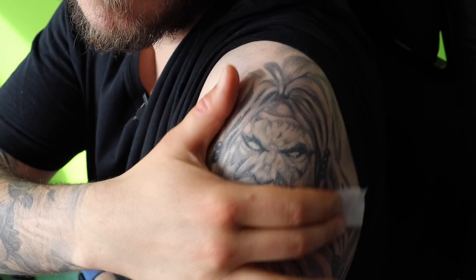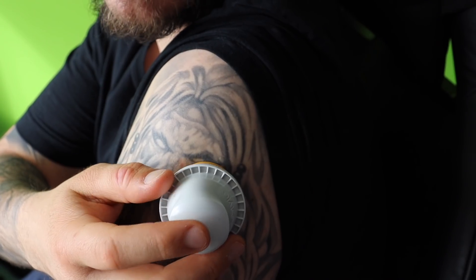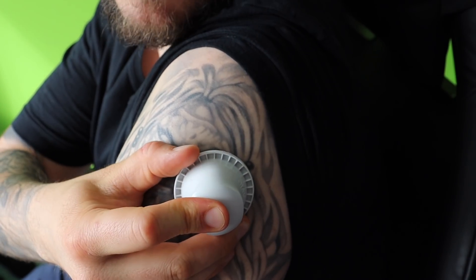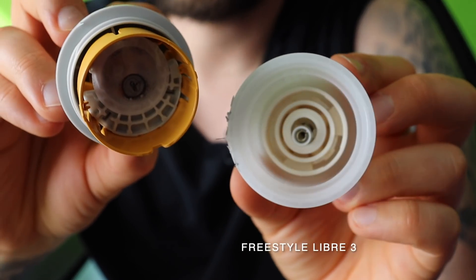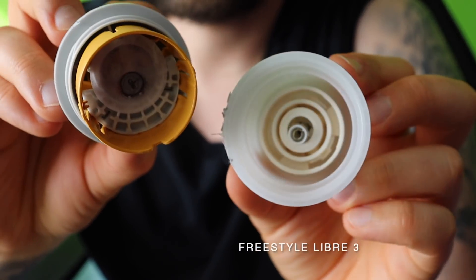By the way, can you show us how you apply the Freestyle Libre 3? Yes, of course. First, you have to disinfect the part of the arm where you want the Freestyle Libre 3 to be. Then you apply the sensor — this is much easier than with the Freestyle Libre 2. You just have to unscrew the seal and apply the sensor. The insertion process looks way easier now that they put the inserter and the sensor in one piece. The Freestyle Libre 2 and Freestyle Libre 1 had the inserter and sensor packed separately and we had to push them together before applying — that step is no longer necessary. You just screw off the lid and apply the sensor.